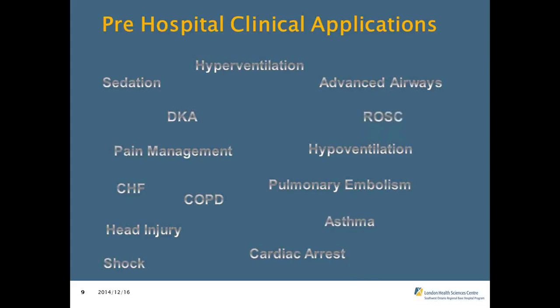That's right. There's many uses for capnography in the pre-hospital setting, but as Christine states, that would be more of an advanced webinar when we go in and explain how it can be used in all these settings. It's important to remember that capnography is just a piece of the puzzle, so it's not going to give you your diagnosis whatsoever.